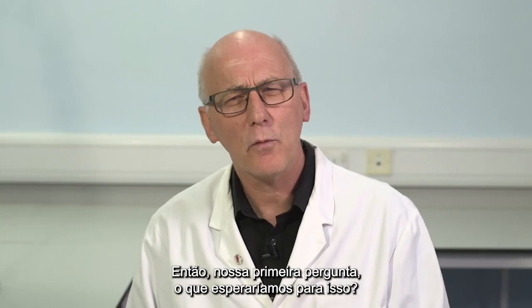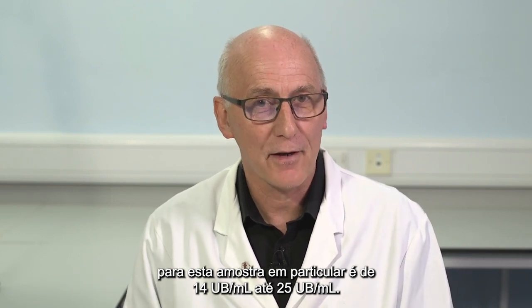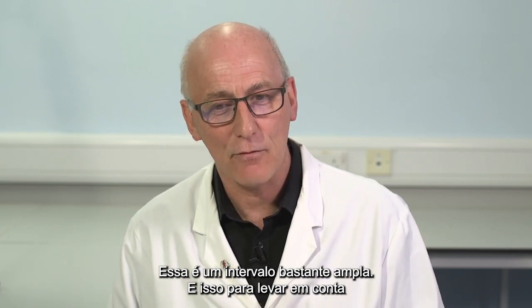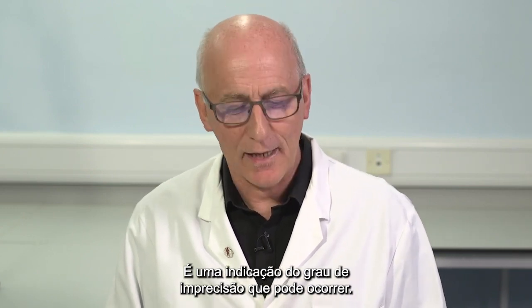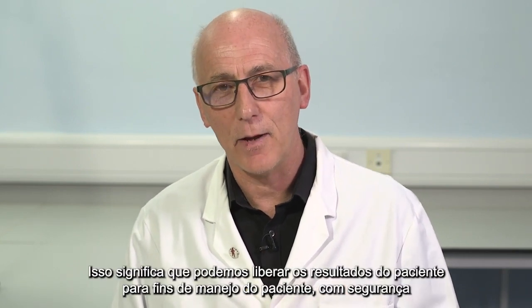So our first question, what did we expect for this? And the anticipated range, the target range in my laboratory for this particular sample is from 14 Bethesda units to 25. That's quite a wide range. And that's to take account of the variability in the assay. It's an indication of the degree of imprecision which can occur. Is that result inside the range? Yes. It means the assay has been successful. It means we can safely release the patient results for patient management purposes.